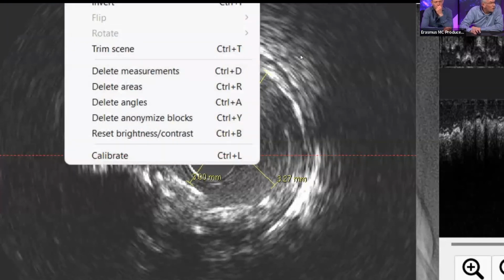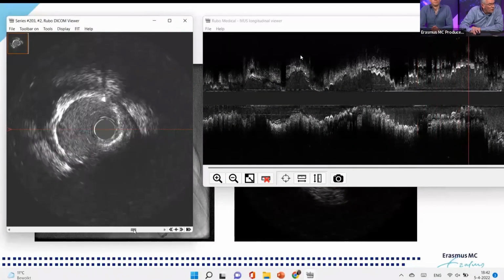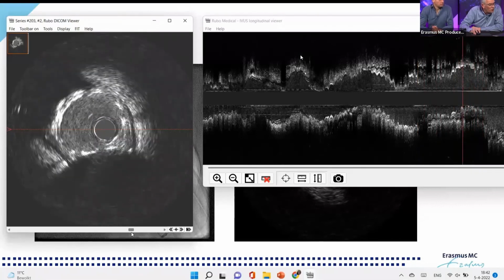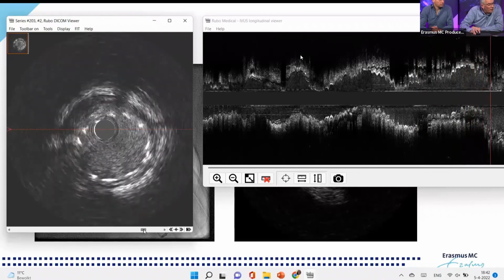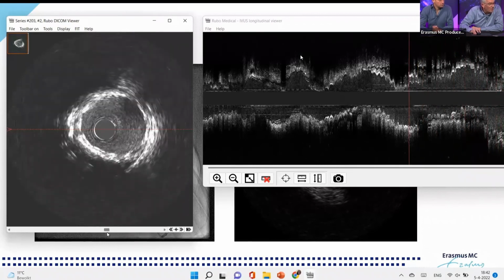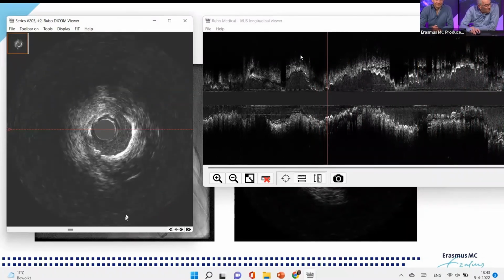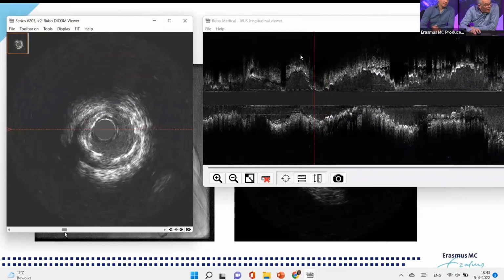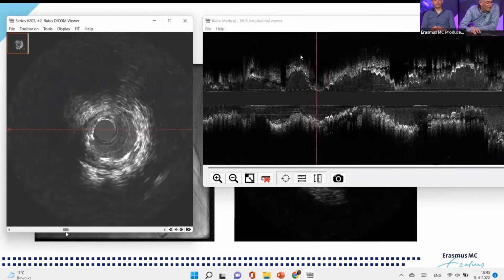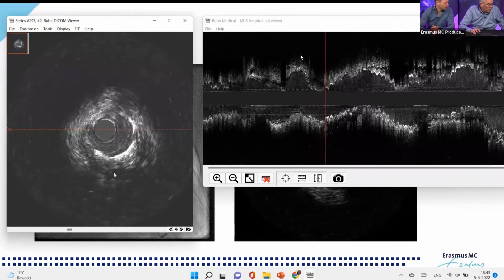And we'll measure the proximal. We had the calcium again, and here we're outside, no edge dissections, and distal we didn't have any edge dissections either. Here is the spot that we want to treat, and now we see that if I compare here, there is a stent, Jurgen, but we need to conclude that the lumen area didn't improve that much. No. Let's see if we can measure this nightmare. So this was around 3.0, right? Yeah, that was around 3.0.